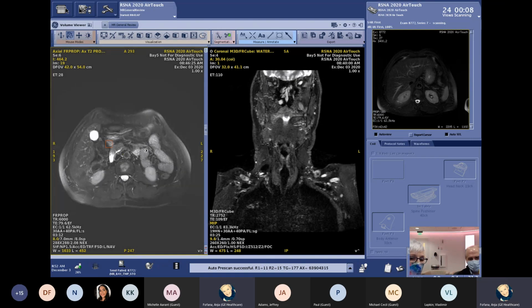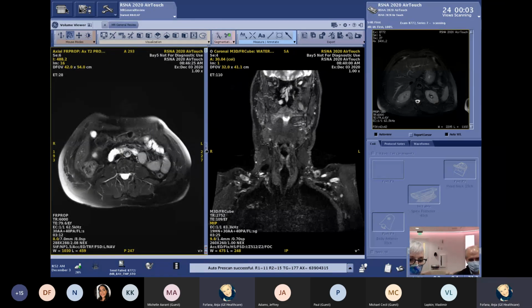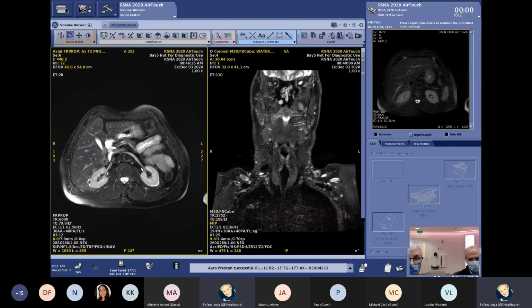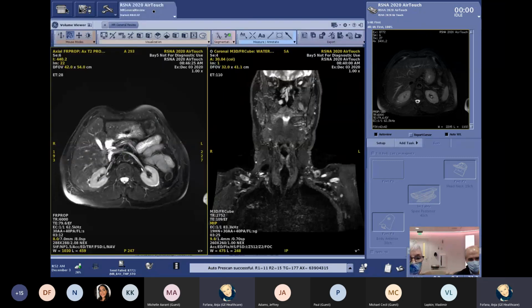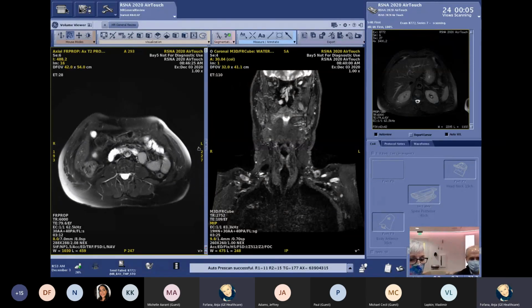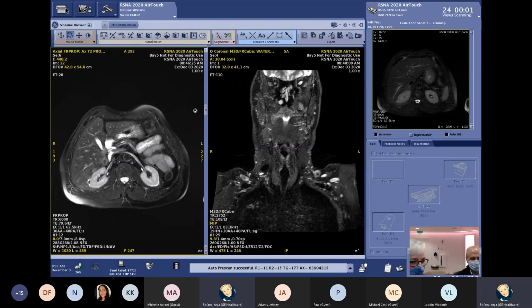And here you see the free breathing T2 image, which we just generated. The scan time in total was 3 minutes. You can see that there is really less motion because we were combining two methods. As we said, we were combining the propeller technique and the navigator. So that really always gives you a good result, even though the patient, as you saw, was falling asleep in the bore.